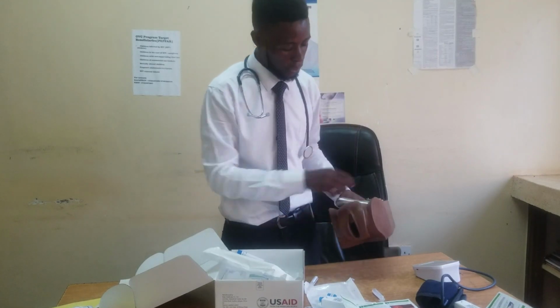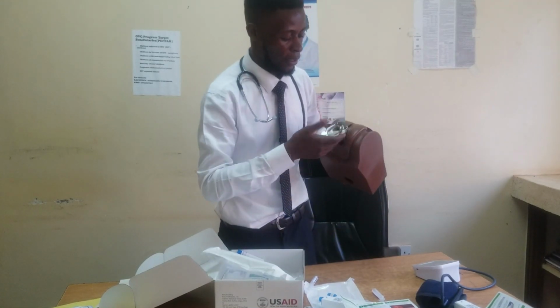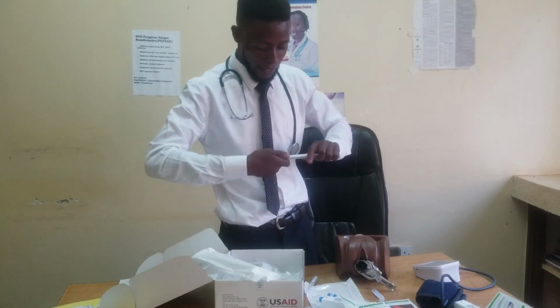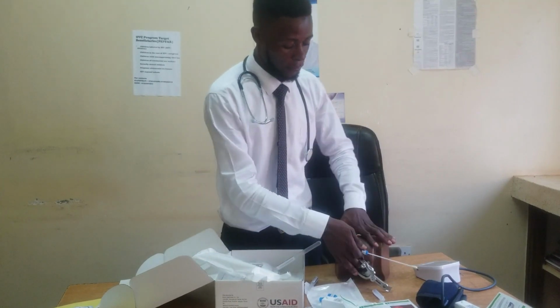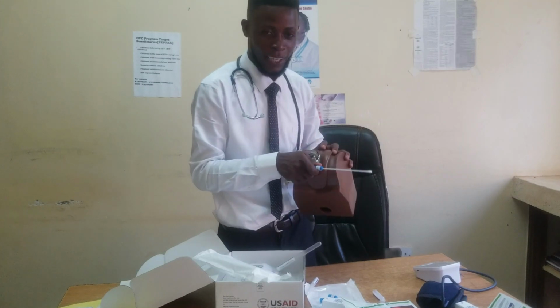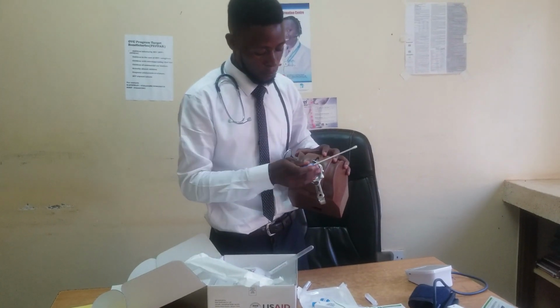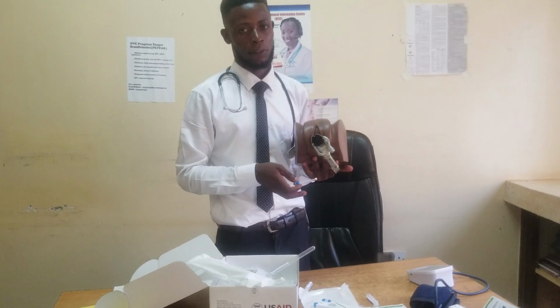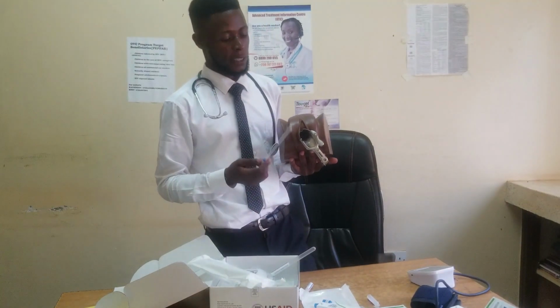Then the other one, using your cusco speculum, mind the edge, then two, mind the dangers, and how to place it. Don't place it from the sides, don't do it like this. So always engage midwives or a gynecologist during a vaginal exam. They have more information and they can guide us very well.